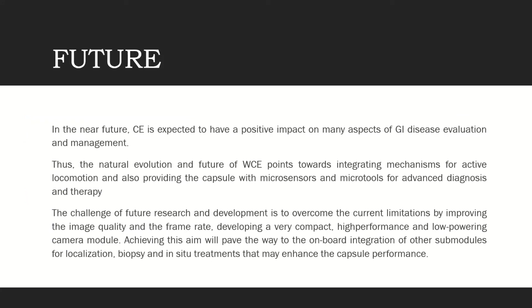It is a very useful device. Its development is also difficult, because basically two things are considered. Firstly, can we direct the movement of the capsule? Secondly, can we get the capsule to take parts from the body, a biopsy?